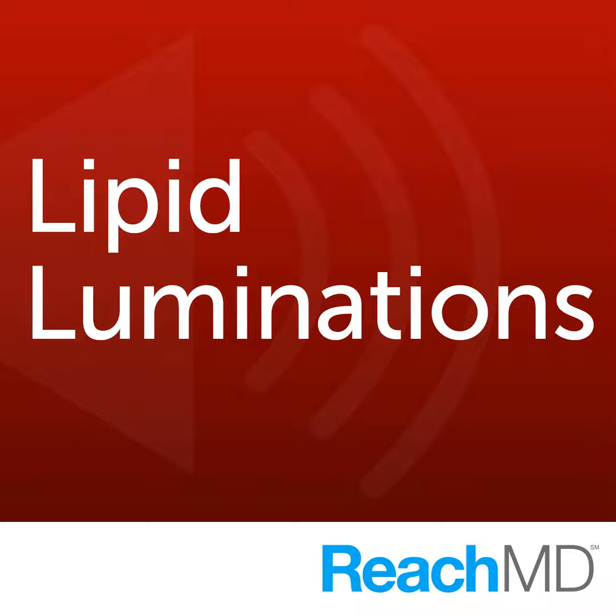They relate to whether carotid IMT can be used as a surrogate endpoint. And so I think that it's difficult to use it as a surrogate endpoint for cardiovascular outcomes. I mean, you certainly can't extrapolate that change in carotid IMT is going to result in change in cardiovascular outcomes.